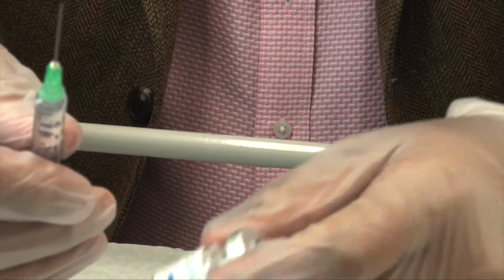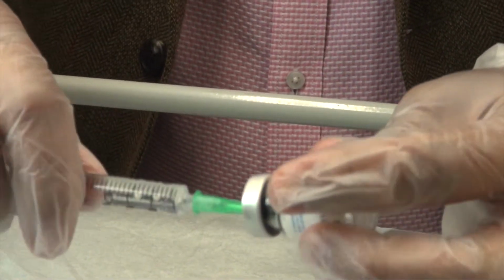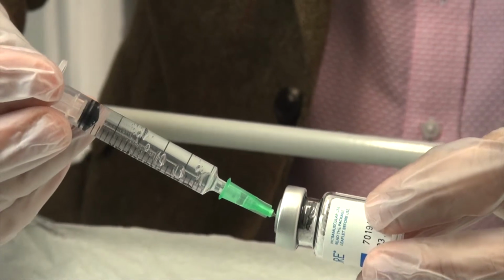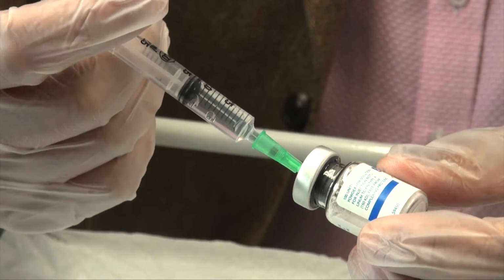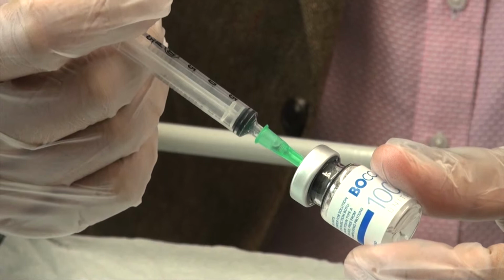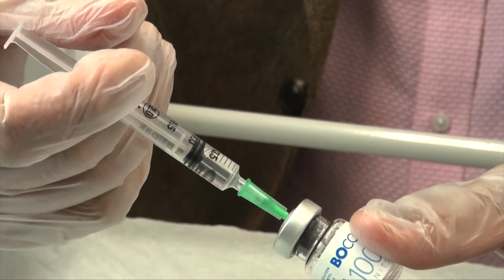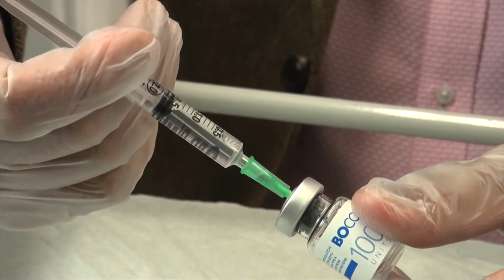Once this is done, I shall introduce the saline again into the vial. As you can see, there's no vacuum, so the saline doesn't automatically jet into the vial. But once again, when we deliver the 2.5 mils of saline gently into the vial, should we decide to release the plunger of the syringe, it will automatically fill with the solution due to the fact that there is now positive pressure in the vial.